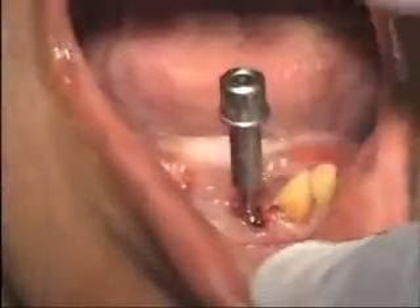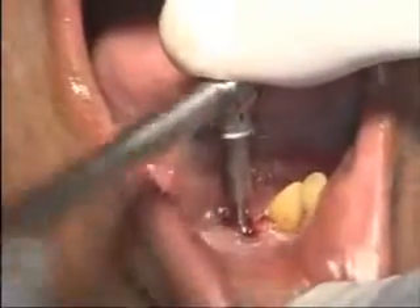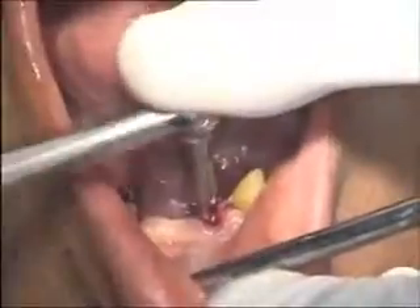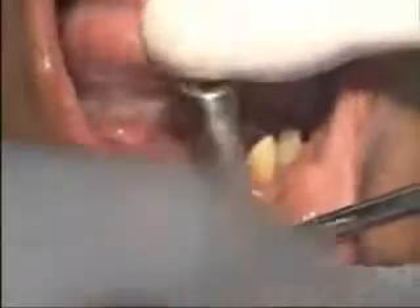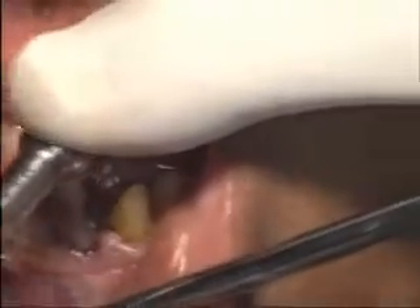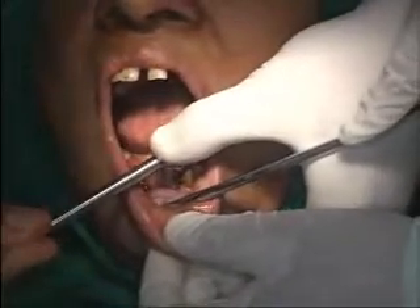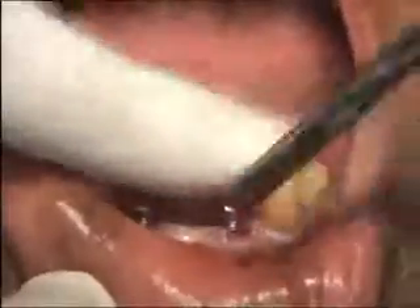Like I told you this morning, it has been ages and ages since I ever introduced a two-piece implant here. This is my favorite way for many years because we have got 100% success ratios. Anybody in the clinic can just feel this, Richard? See — too much. That's the beauty. Now it has got bioactive engagement. See the cutting — the level of this implant is again fine, I will not have to cut it. Now if I want to check — see the wound, it is closed almost here.